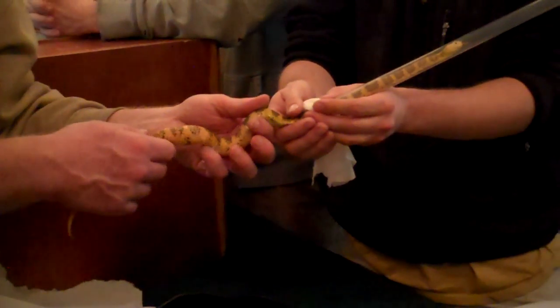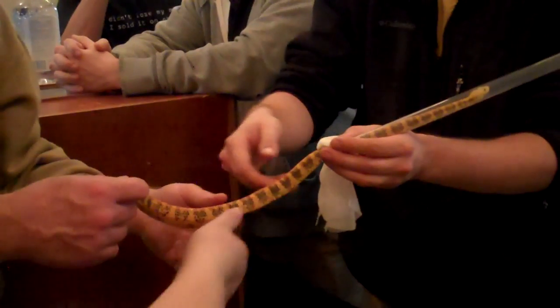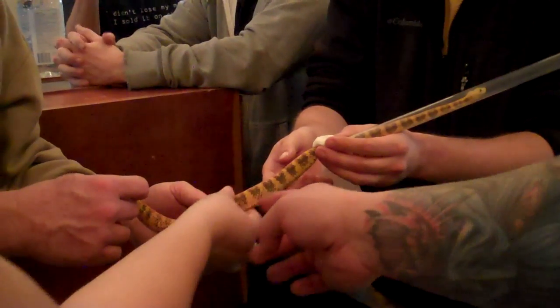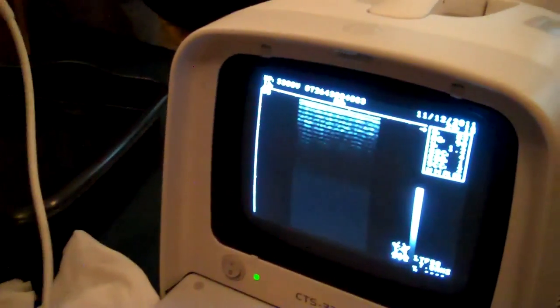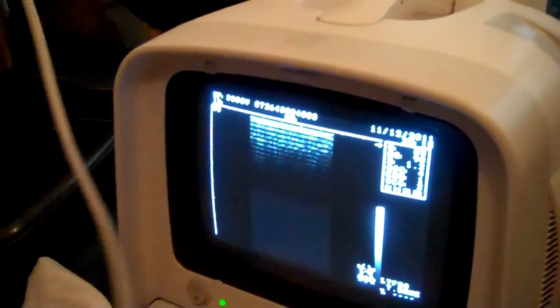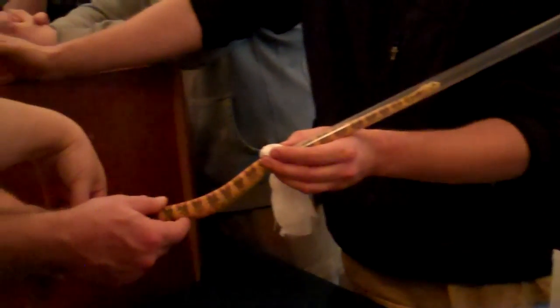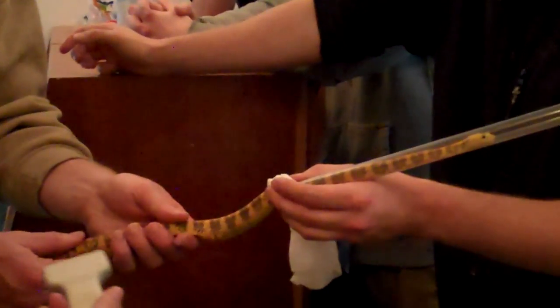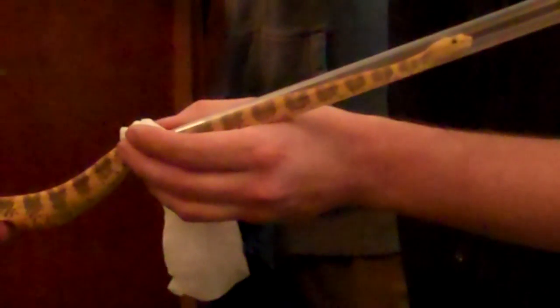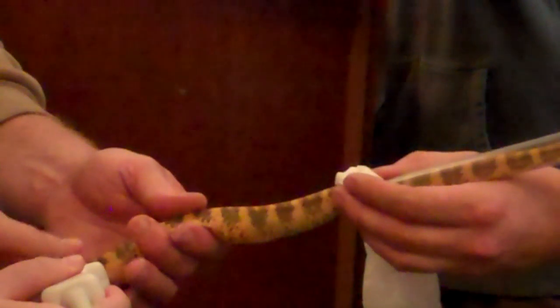But it's quite possible. They're so small, right? What's in there? I mean, feel this, it's distended from this fluid. Even in the ultrasound, I'll clear this out so I can show you. Have you tried to make him poop? Not on me. You could feel how squishy it is. It hasn't pooped or urated in a while, and that's what it's showing up on the ultrasound too. You could see that it's a fluid. There's a whole section. So unless it's urates there, we're palpating. That's totally possible. I would think the follicles would be far out. Yeah, they're up here.